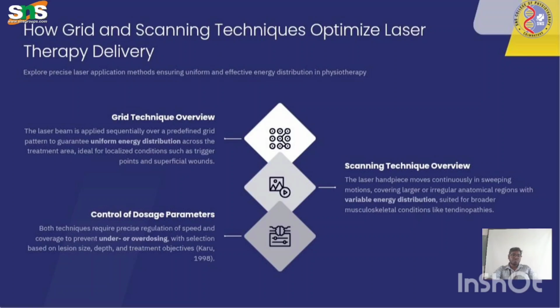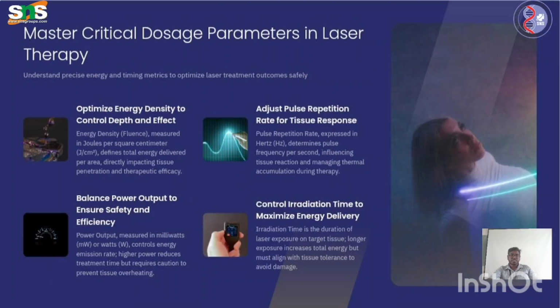Both techniques require precise regulation of speed and coverage to prevent under- or overdosing, with selection based on lesion size, depth, and the treatment method.